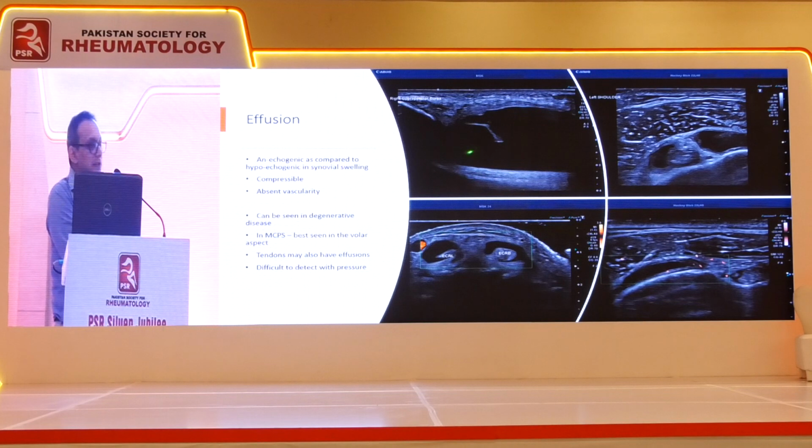This is a knee joint, and this is the patellar surface. Here we have the femur, and this is the suprapatellar pouch, where there is a huge effusion, with some extension of soft tissue inside, which is visible. This is the shoulder and biceps, with swelling and fluid around the biceps tendon, and we can see a part of the subacromial subdeltoid bursa with fluid in it. It's a patient who had polymyalgia rheumatica, and you can see the presence of fluid effusions there.